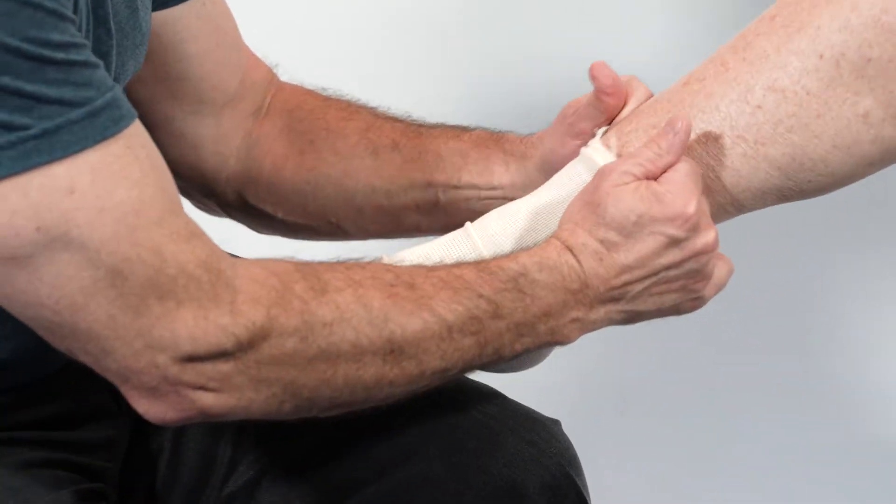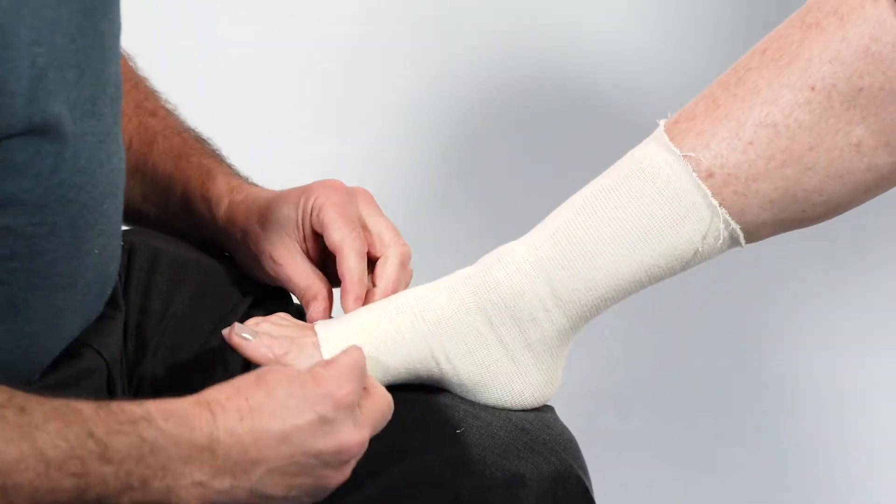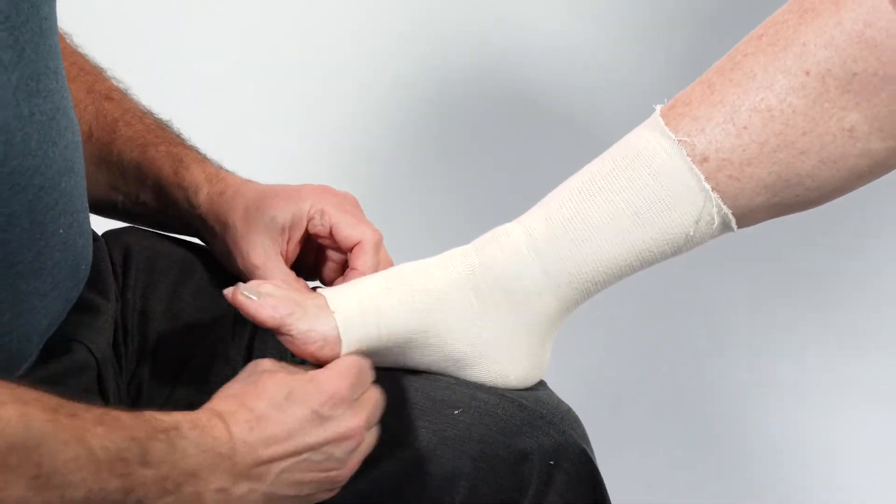In this case a size C is tried, but it's determined that a size D gives support of the ankle and is comfortable for the patient.